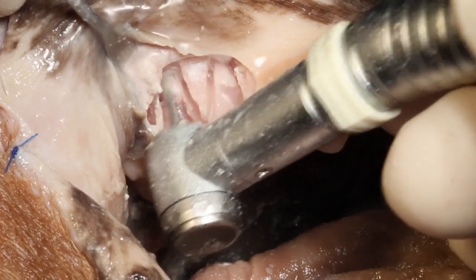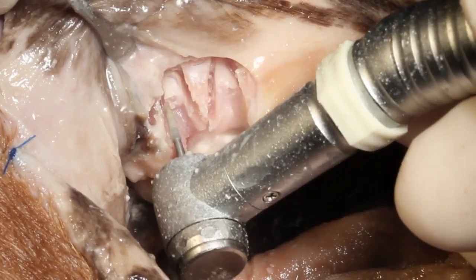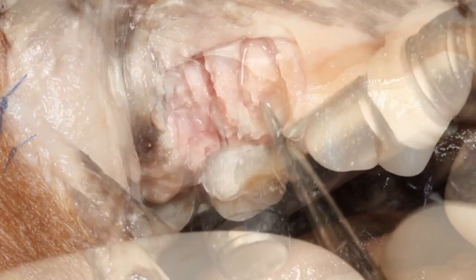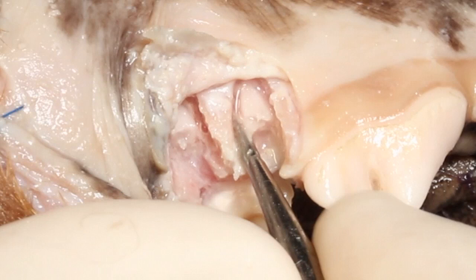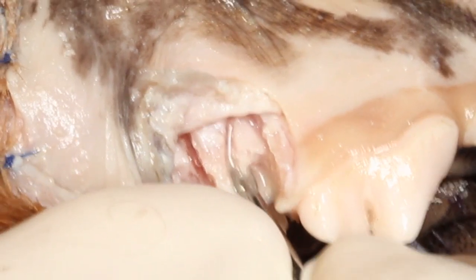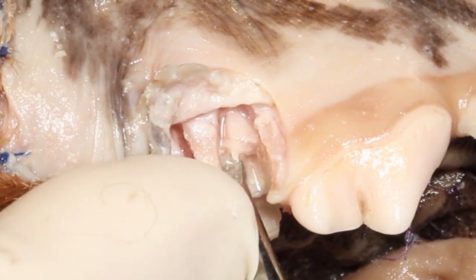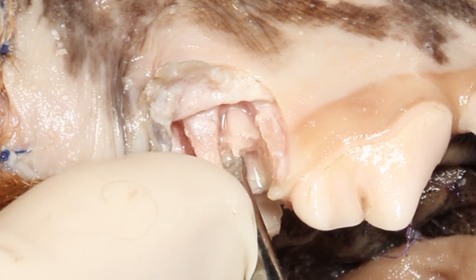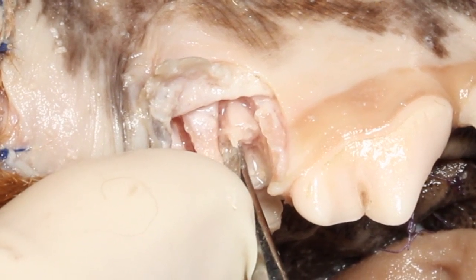Once that's finished, you can take and lever that out with your elevator. You can see we actually created a little groove on the palatal side too, so we can get that luxator up underneath and move the tooth from palatal to vestibular. This makes it easier to extract than trying to move it mesial to distal or distal to mesial.